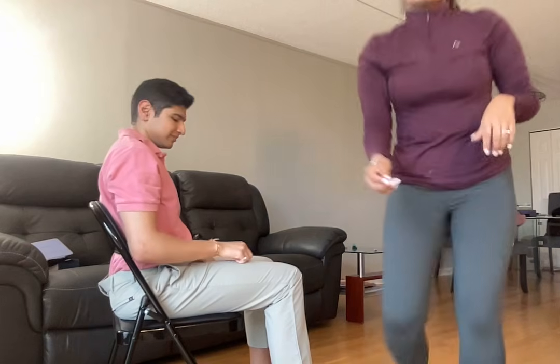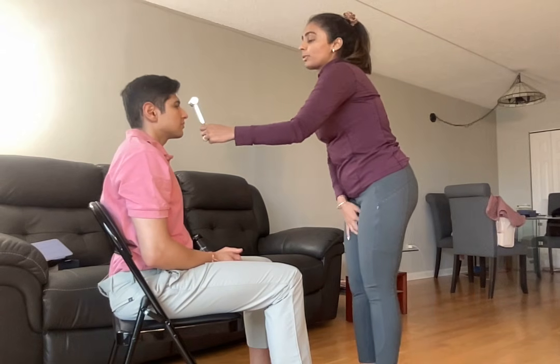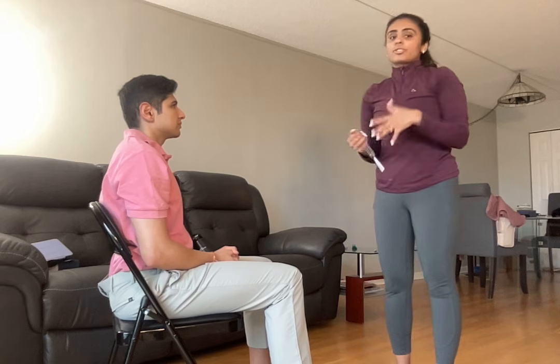And now we are going to do a Weber test. And that is to check for lateralization of sound. Tell me if you hear it equally on each side or on both sides. Yes, I do.